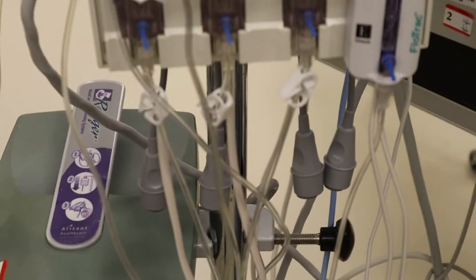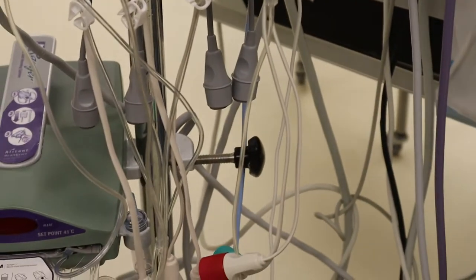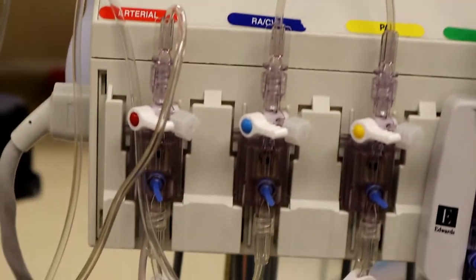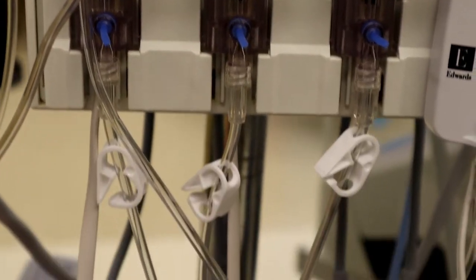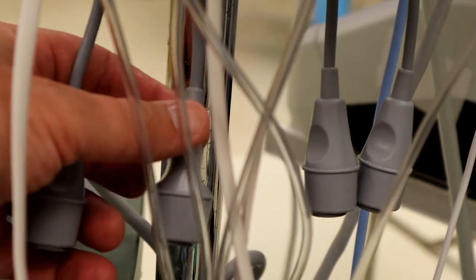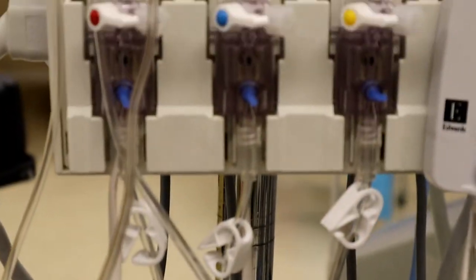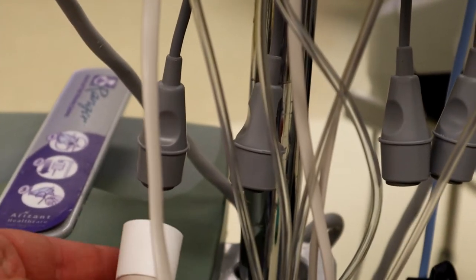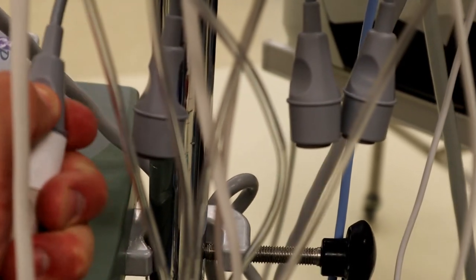After this, I'll show you how to connect these transducers to the Edwards monitor to make sure you're getting the right input. To connect our transducers — on the left we've got our radial arterial line. In the back of our hemopod you'll see four connections that correspond with our four transducers. On the radial arterial line, we'll take the half of the pressure cable that comes down and connect it straight into the back of our first spot. That'll be our radial line.